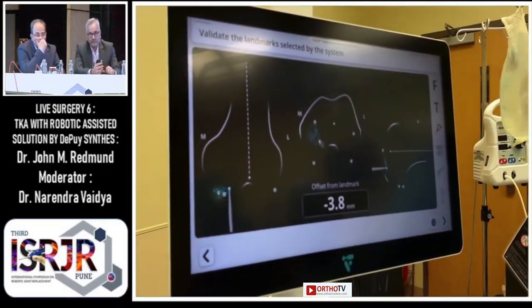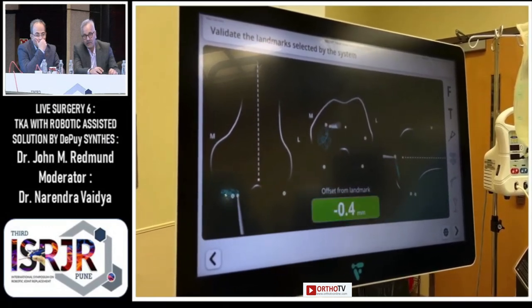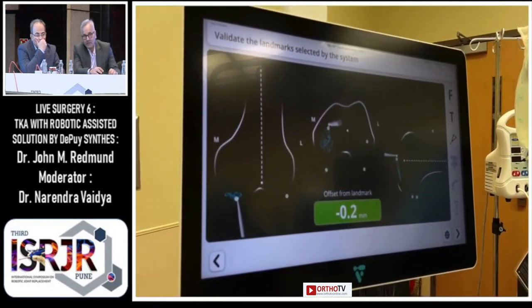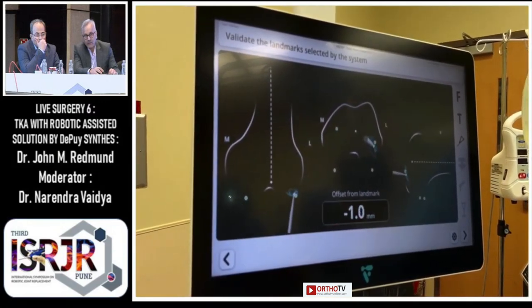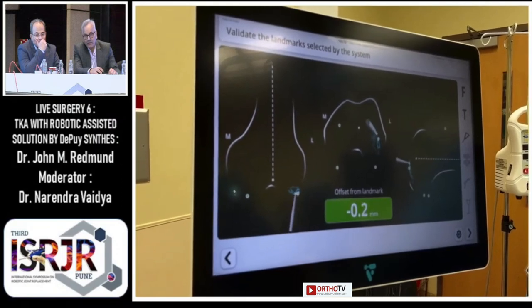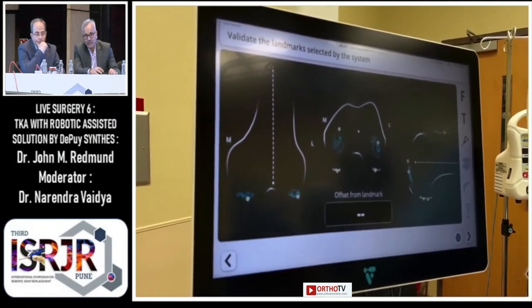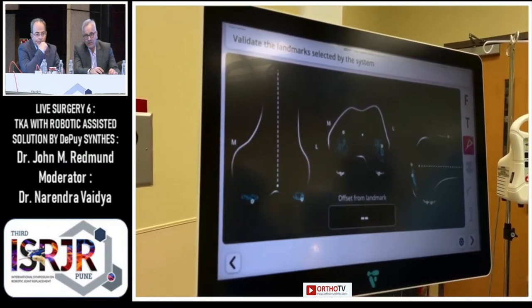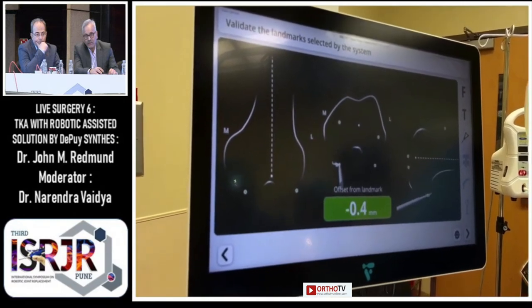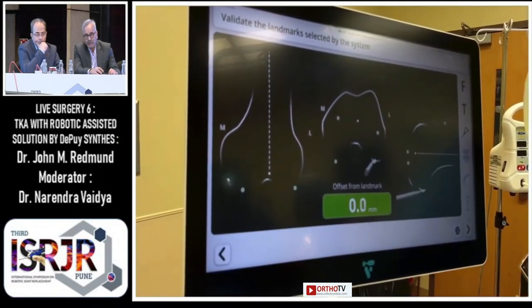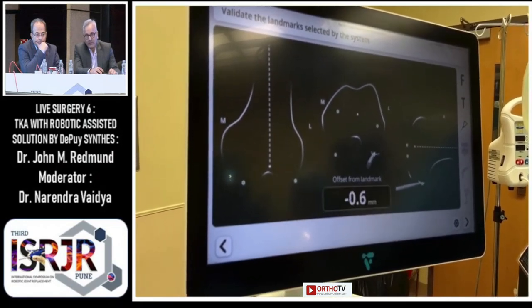Right now I'm confirming the registration. On this screen I'm verifying that the points the computer has chosen are in fact the most distal and posterior points on this patient's knee. You can see a cloud of points, and I'll run my pointer along the bone to make sure there are no points more distal or more posterior than what I've collected — basically verifying the model.